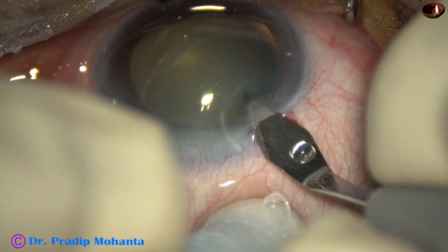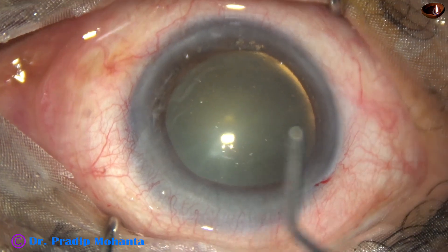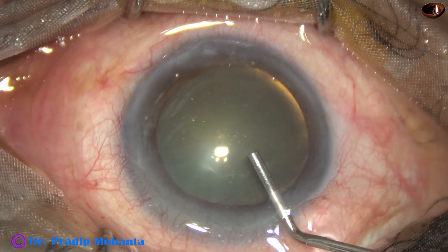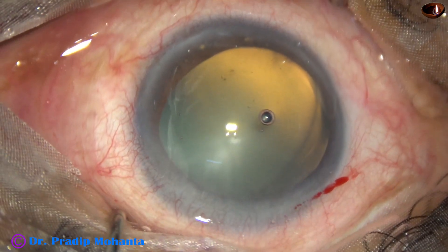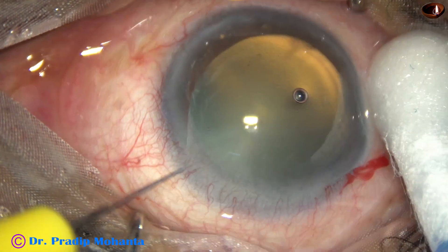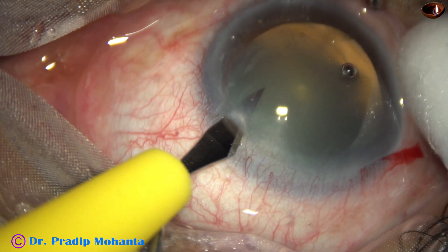This is the main incision with a 2.8 millimeter steel keratome. The anterior chamber is filled up with 2% hydroxypropyl methyl cellulose. Methyl cellulose is also applied over the cornea to improve visibility. A small side port is made on the left side of the main incision.